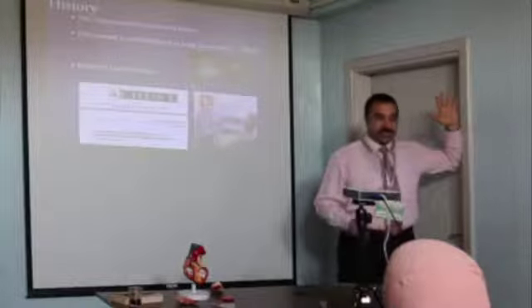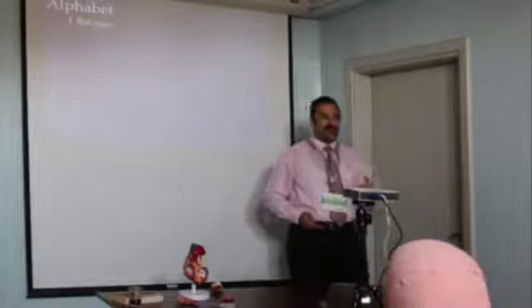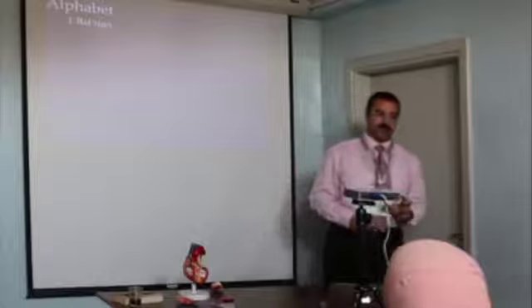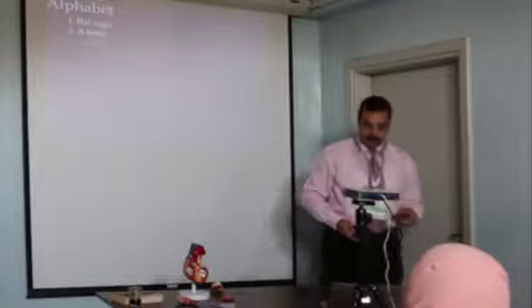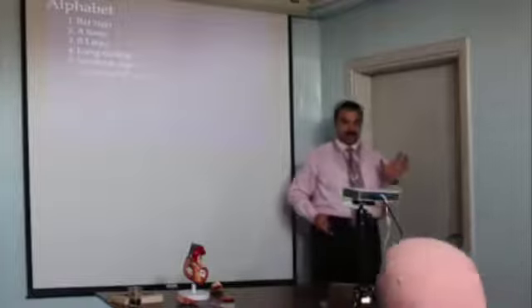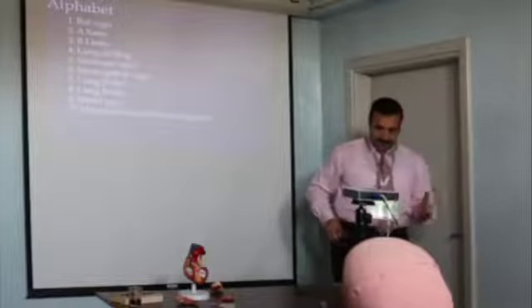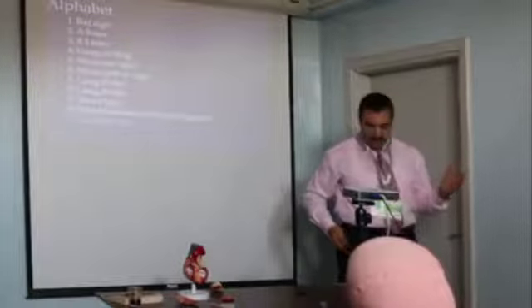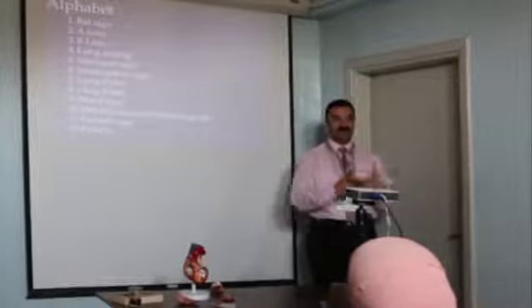So thanks, Daniel. We need to know the alphabet, and this is the most difficult part of ultrasound lung. So we spend some time to teach you the alphabet of ultrasound lung before we proceed to the BLUE protocol: bat sign, A lines, B lines, lung sliding, seashore, stratosphere or barcode, lung pulse, lung point, shred sign, hepatization, air bronchogram, consolidation, curtain sign, collapse. All these are new signs for almost all of us.